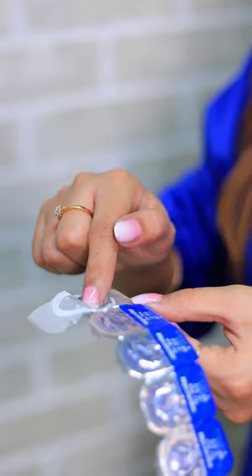How to wear lens. Wash your hands and dry them thoroughly. Use the padding of your pointer finger to pick up the lens.